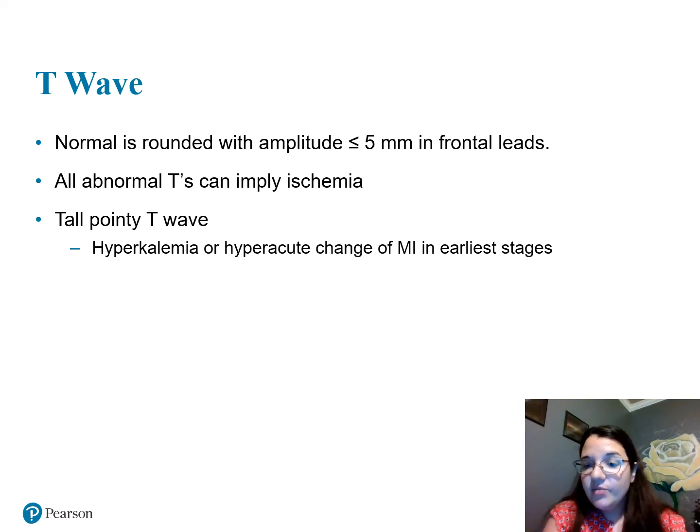So remember, right now we're looking at heart attack. You have your 3 I's: you have ischemia, you have injury, and you have infarction. If I'm ischemia, I'm going to appear to be a palish color, a white color, and my T wave is going to be inverted, but it could also be abnormal. If I'm injury, my ST segment is either going to be elevated or depressed. If it's elevated, I can be concave or convex. And if I have elevation, I could have injury. If I have depression, I can have ischemia and then infarction.